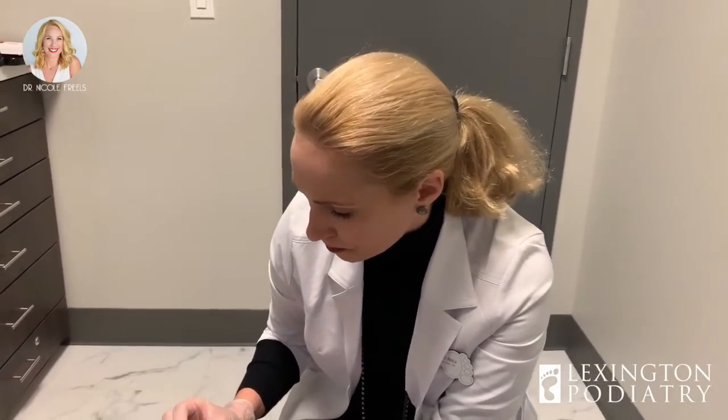I have a unique case for you today. This gentleman had his ingrown toenail removed a couple months ago, and the procedure went pretty well, and then he experienced a lot of drainage after. He said, we're a little unsure if there was chemical applied or not. He said there was a stick and something was put in after the nail was removed. So that kind of sounds to me like what we normally do to put the chemical on.